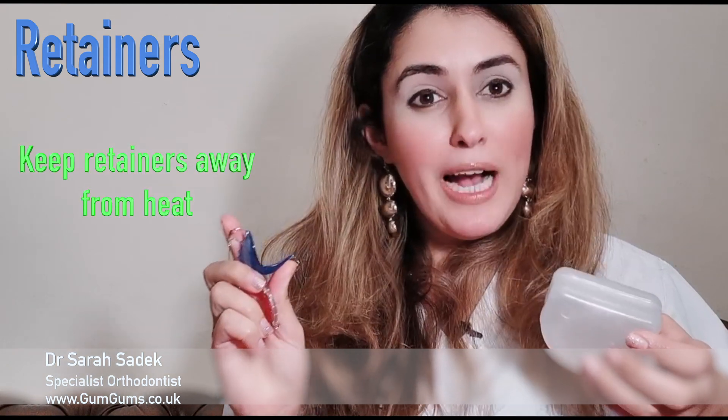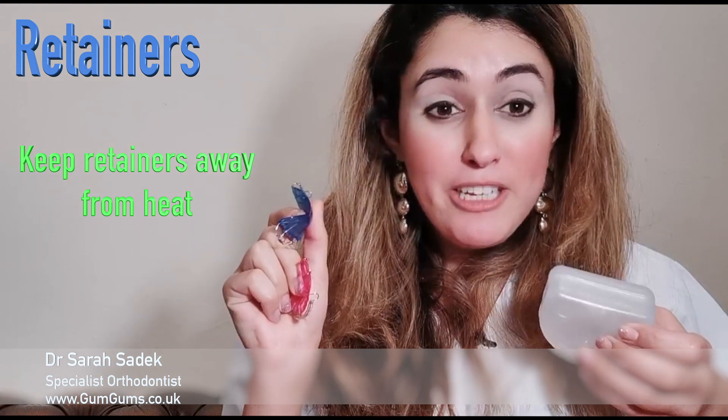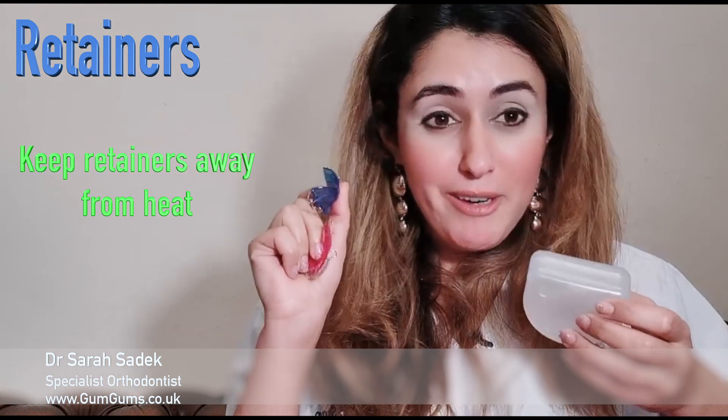Whatever type of retainer you have, you need to make sure you clean them with lukewarm water, not hot water, because they are made of plastic and they will distort if they're exposed to heat.